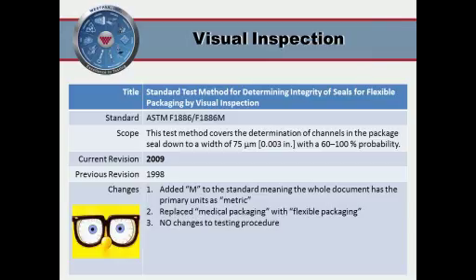As an engineer doing these types of tests, I have standard deviation down to 0.03 using the unsupported technique. So it does not matter which technique you use as long as you're consistent. Your manufacturer for the pouches probably has one particular technique, because one technique will yield different results compared to another technique. So once you pick a test and you get 5 pounds, you get 2 pounds, you're like, why aren't they matching? So just ask them. I'm pretty sure they know the technique.